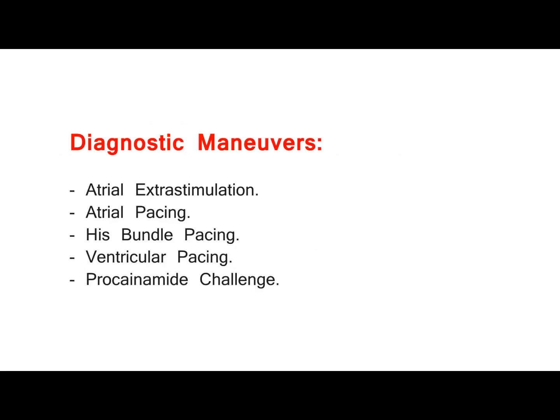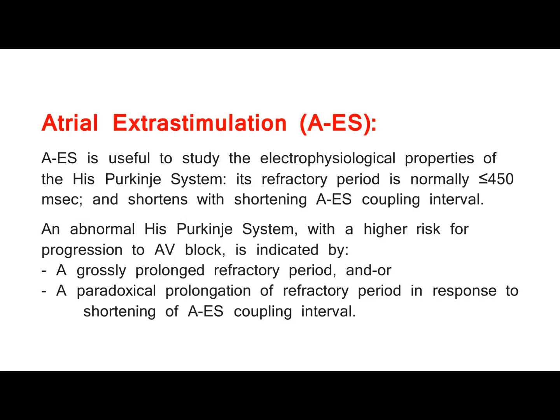Diagnostic maneuvers. Atrial extrastimulation. Atrial pacing. His bundle pacing. Ventricular pacing. Procainamide challenge. Atrial extrastimulation, AES. AES is useful to study the electrophysiological properties of the His Purkinje system.